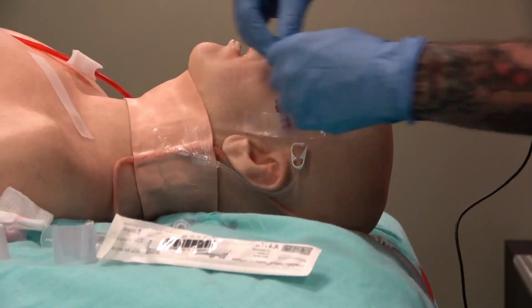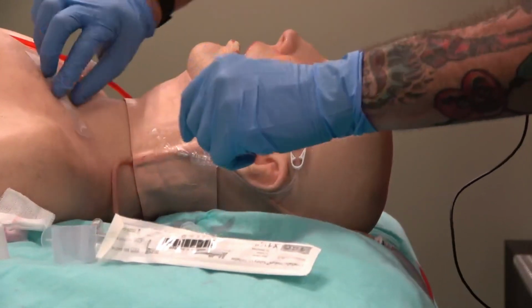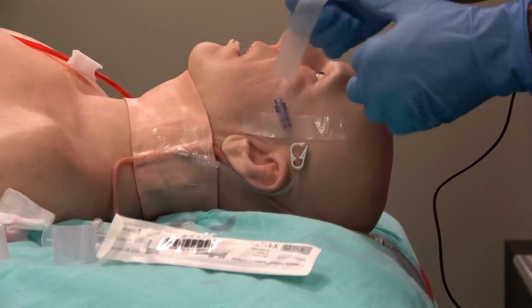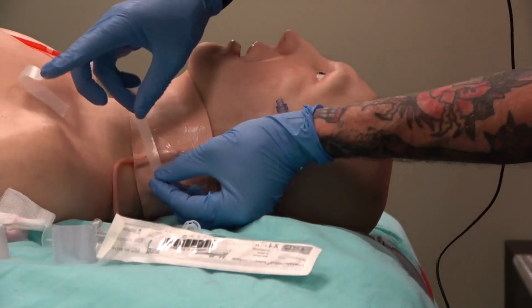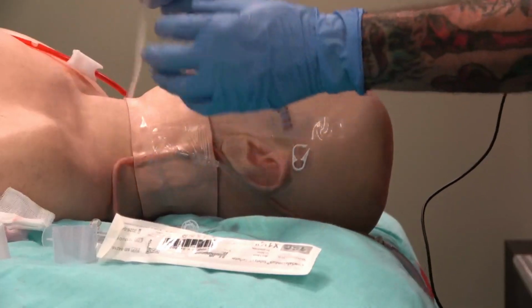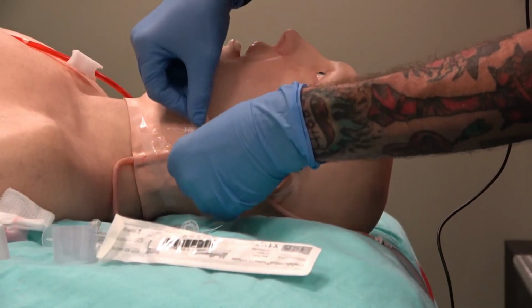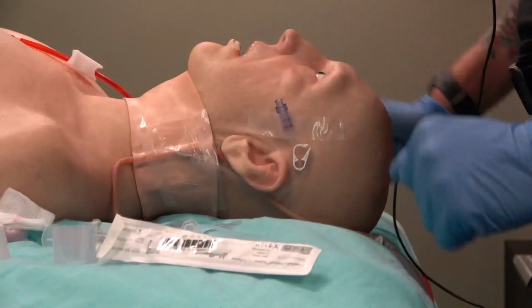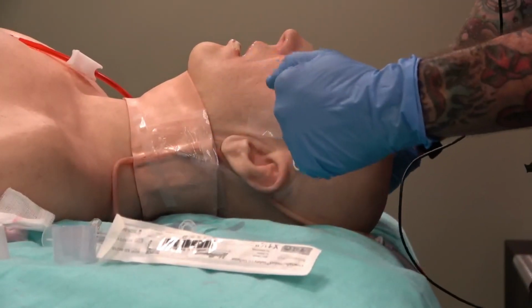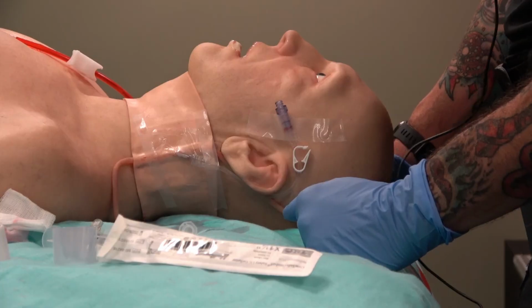tape it on there, and then what I like doing, you don't have to do this, this is just a Taylor thing. I like putting a little tape at the bottom of my Tegaderm and a little tape at the top. Losing an IV is not fun, especially one that you worked pretty hard for on someone who really needs it.